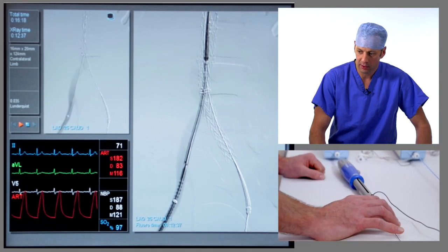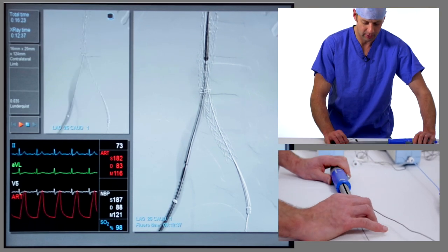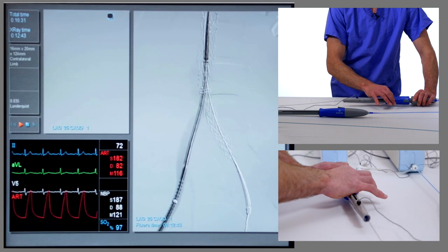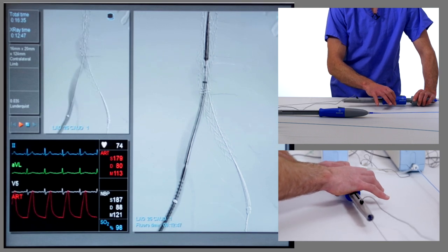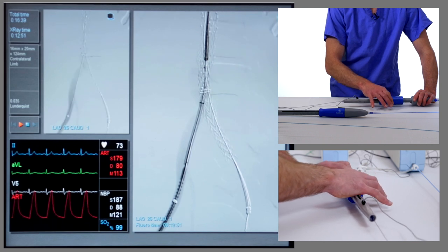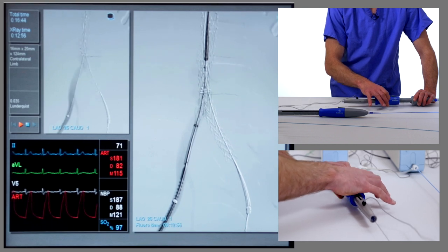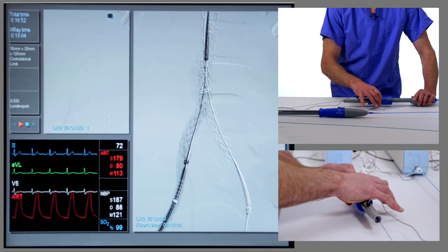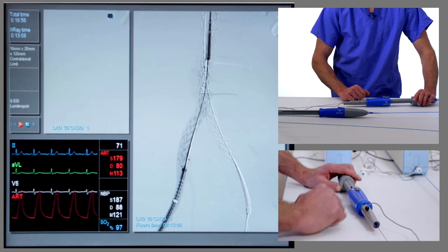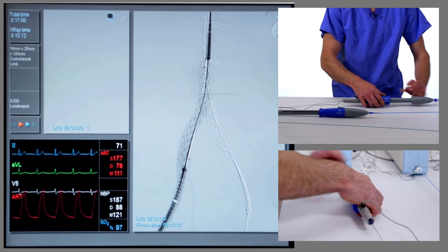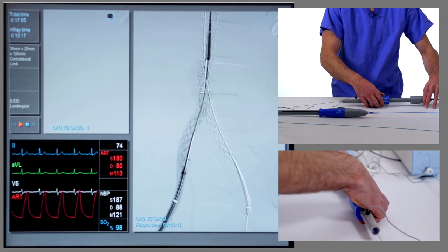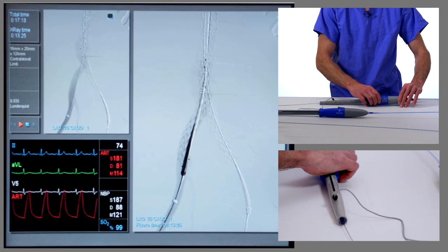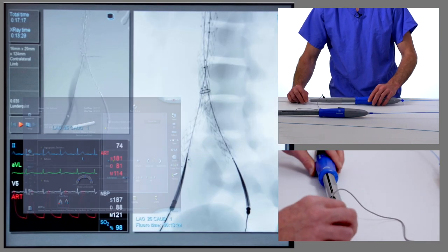Most importantly, at the distal end, the distal markers of the limb will not be covering the internal iliac on the right. We keep that in position and, just as we deployed the main body, we use the blue handle and rotate it round — keeping the graft in a nice position, not advancing or withdrawing the delivery system — rotating all the way until the graft is completely uncovered. The graft is fully open. We then recapture the nose cone by pulling back on the grey trigger, holding the blue handle with the right hand still, pulling the nose cone back until the two are docked together, and then withdraw the delivery system out through the sheath.